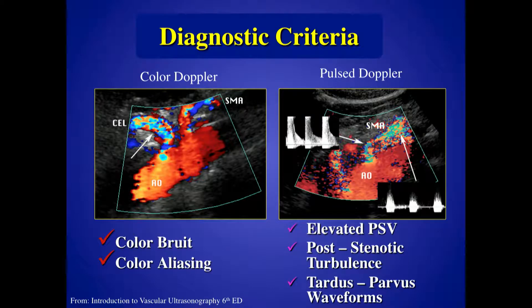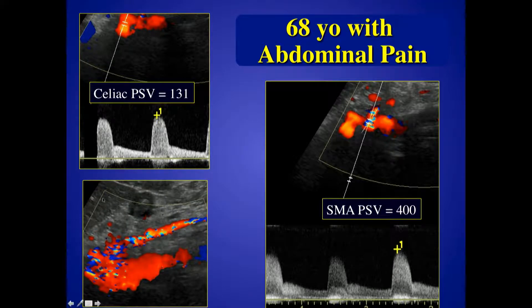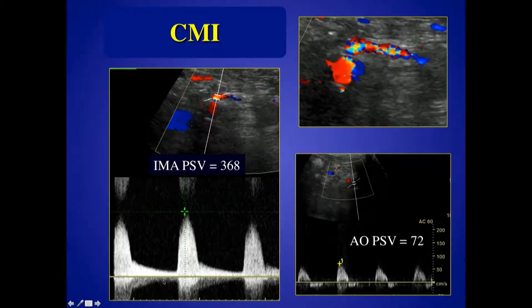The color Doppler will show you the aliasing and bruit artifacts; the pulse Doppler will give you the high velocities, abnormal ratio, and post-stenotic turbulence with tardus-parvus waveforms. Here's a 68-year-old presenting with abdominal pain. The celiac has a velocity of 131, in the normal range. The SMA is elevated at 400, with a bruit artifact right at its origin. The IMA velocity is also elevated, and you can see the abnormal flow in the IMA compared to the aorta. Two-vessel disease — classic chronic mesenteric ischemia.